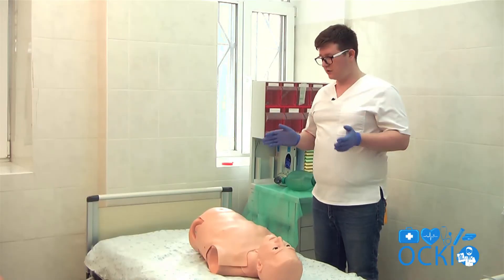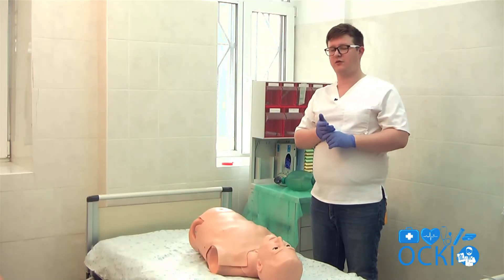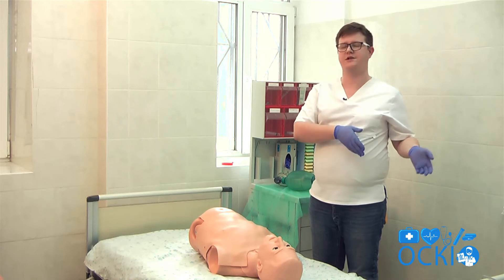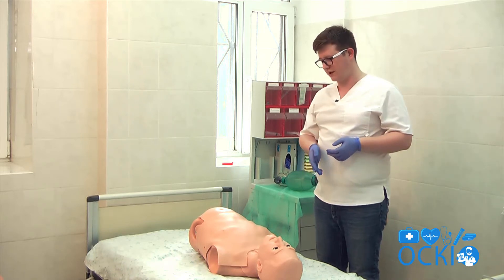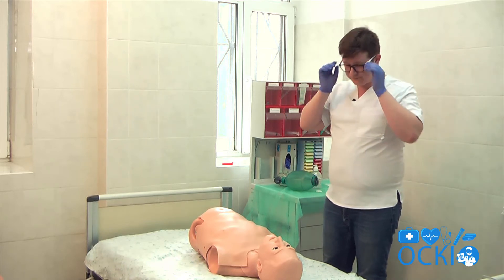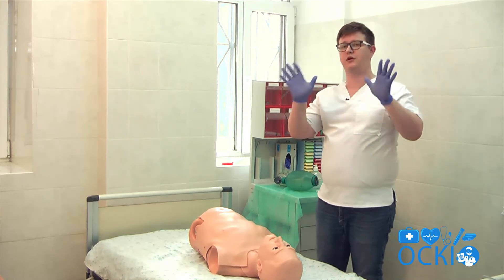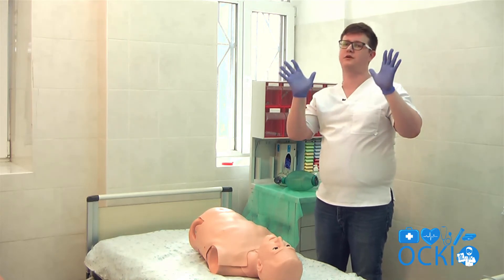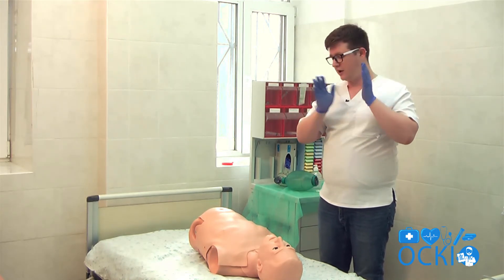Today we will learn the algorithm for scenarios with ventricular tachycardia and ventricular fibrillation. First of all, you should wear gloves before performing any manipulation.